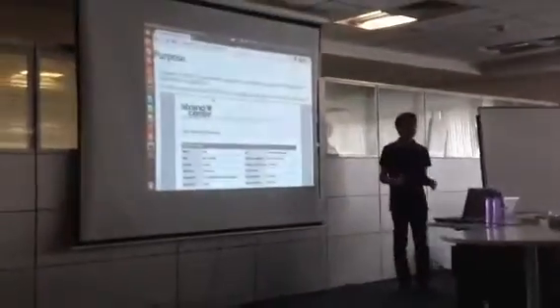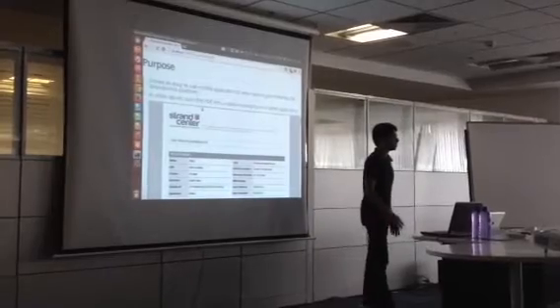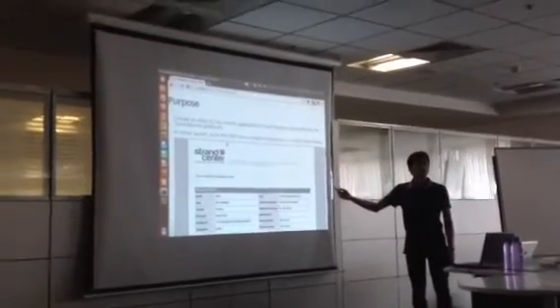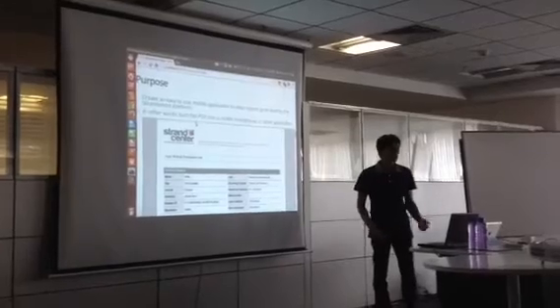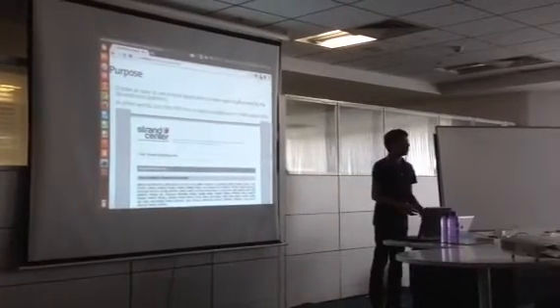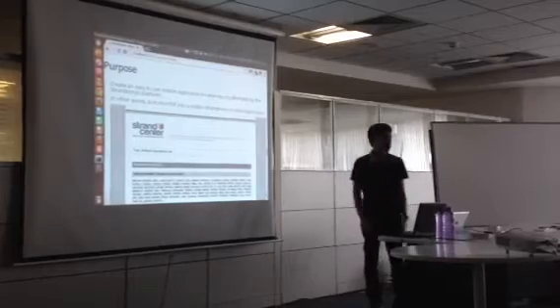So the purpose of the app was to create an easy-to-use mobile application to view the reports generated by the Strandomics platform. Basically, you would get these 20 or so page reports when your case was completed or closed. So instead of the doctor having to go through all these pages, we decided to come up with an app that laid this information out in an interactive and easy-to-use manner.